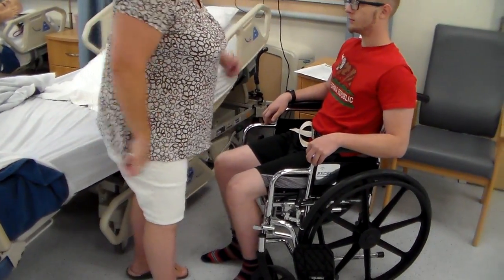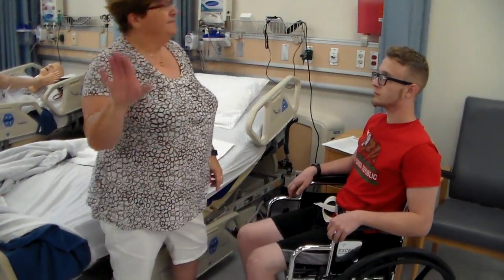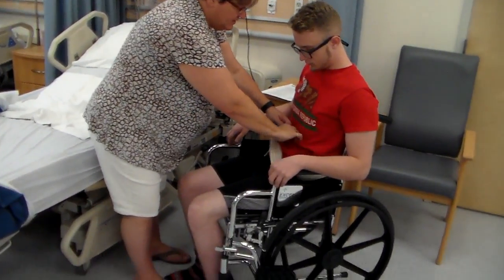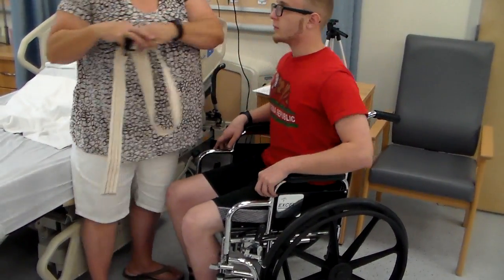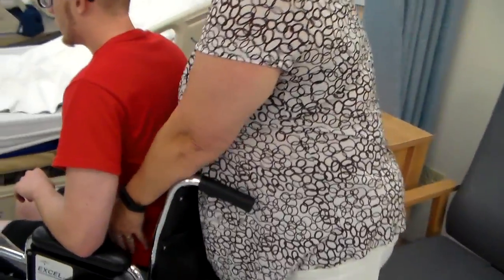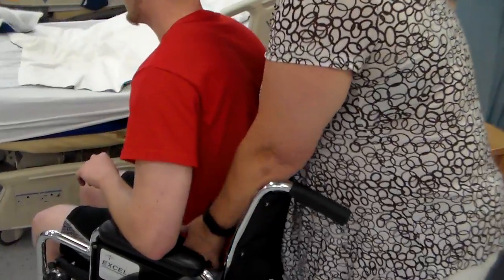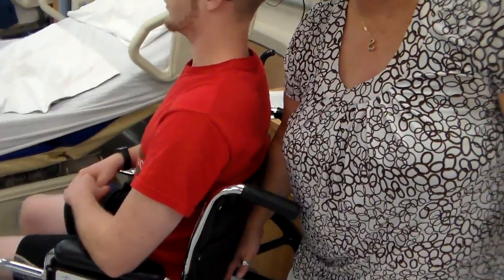Okay? All right, so now I've got my patient in the chair. And you're saying, okay, we're done. You're not done, okay? First of all, you have a belt on them. So you're going to take the belt off. Okay, can you lean forward? There you go. Now, you might also have to go behind the chair, okay, and assist them into the back. You would have done this before you removed the belt. If their behind wasn't fully on the back of the chair, you could take the belt and lift them so that their back and their rear end is towards the back of the chair. Okay, so you want to make sure that is done.